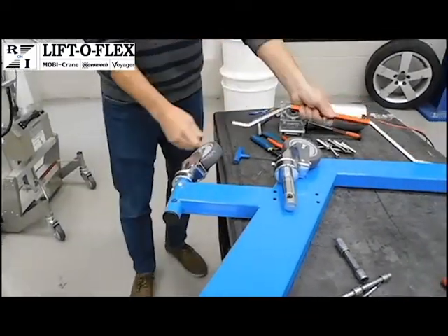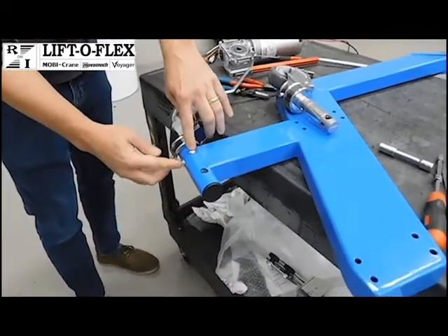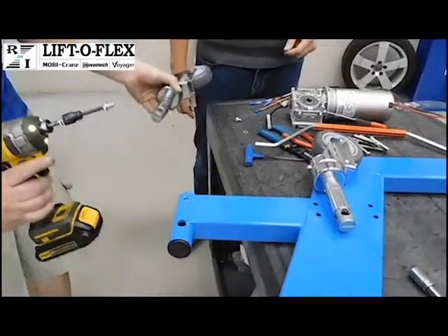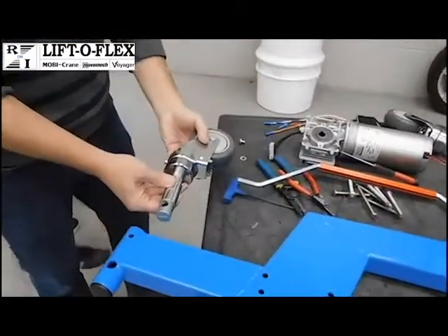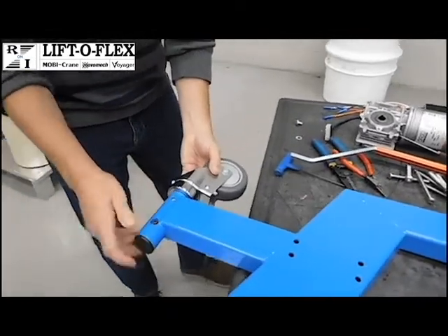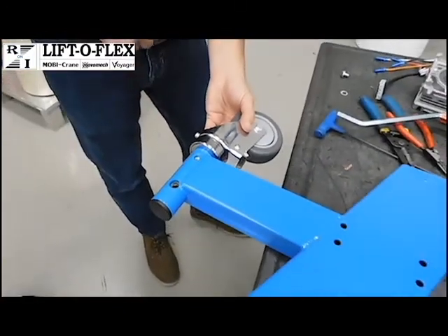We'll now go ahead and remove the old caster by removing 2 M8 bolts. These are, again, 5mm Allen wrenches to remove those. The new caster, keeping the orientation the same way, is inserted into the leg post, and it keeps the brake engagement lined up with the open hole in the leg.